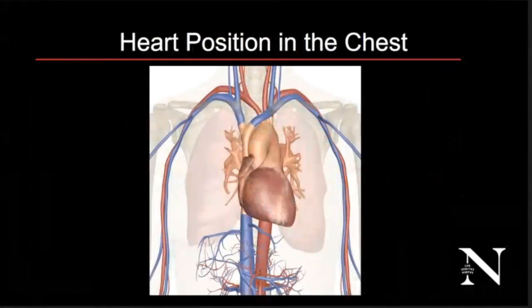You have to understand how the heart sits in the chest to do this study. And you really have to understand how your structure sits in the body to do any study. Basically, what you're doing when you do an ultrasound is taking a ninja sword and slicing whatever you have into two pieces and then looking at it, right?